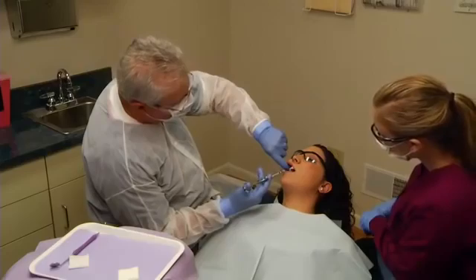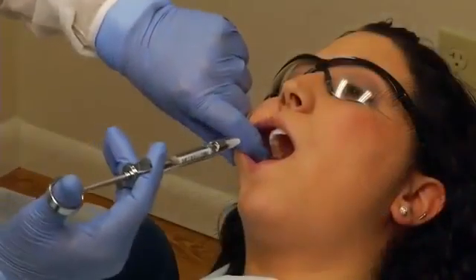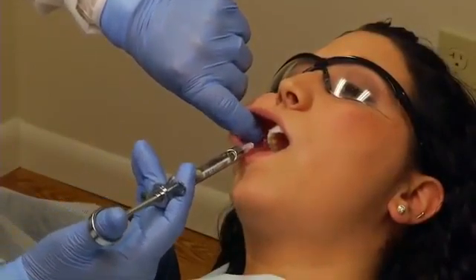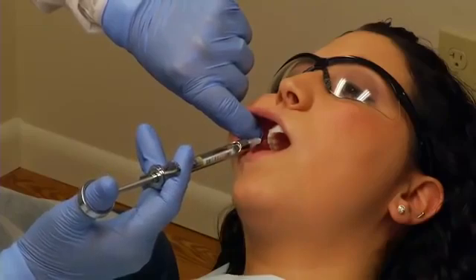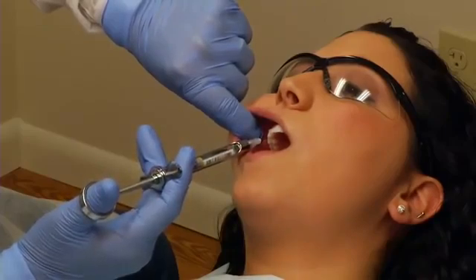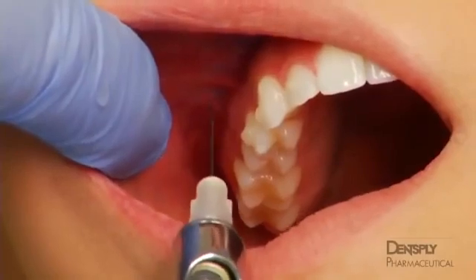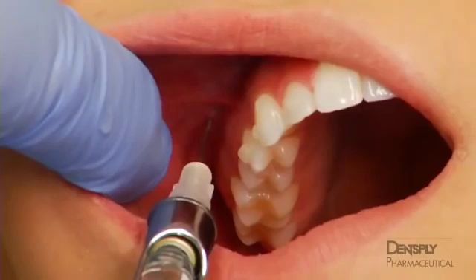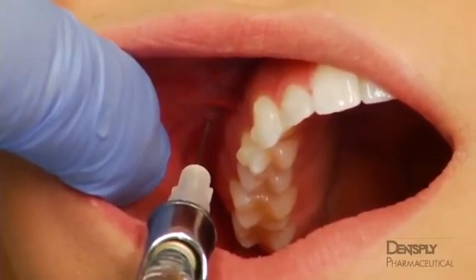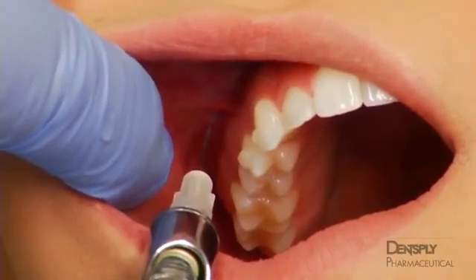Using a 27-gauge short needle, orient the syringe parallel to the long axis of the tooth with the large window facing the operator. Insert the needle at the height of the mucobuccal fold at the apex of the maxillary second premolar, approximately 1/4 of the depth of the short needle, about 5 millimeters, or until the bevel is slightly superior to the apex of the tooth. Aspirate within 2 planes. Slowly deposit 0.9 to 1.2 milliliters of solution, about 1/2 to 2/3 of a cartridge, over 60 to 90 seconds.